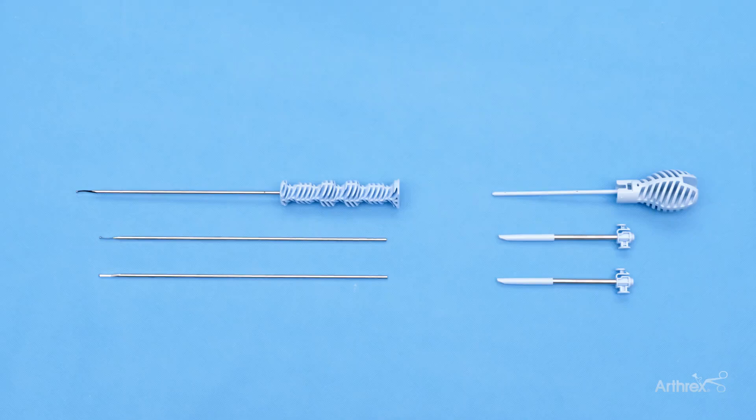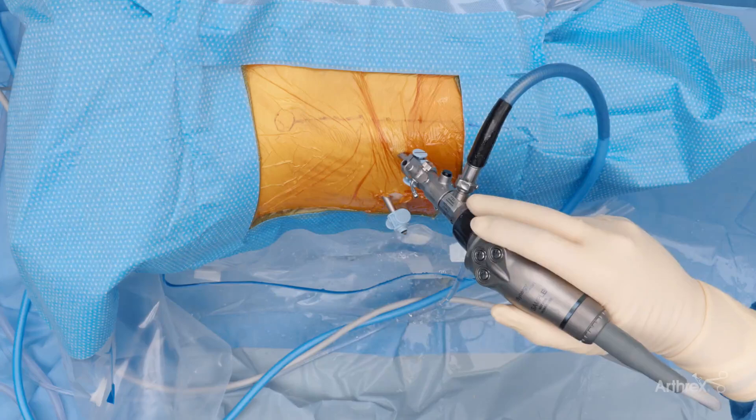In addition, it can be used with or without an ergonomic handle for ease of use. My preference is the non-handled version, which can simultaneously be used as a switching stick, eliminating multiple extra steps in traditional capsulotomy creation.